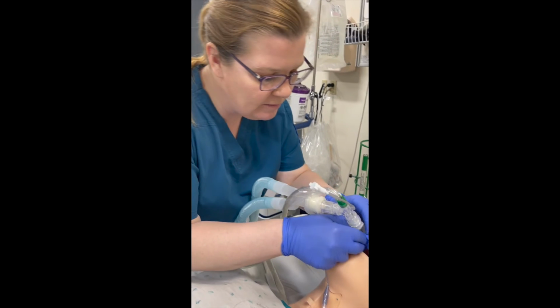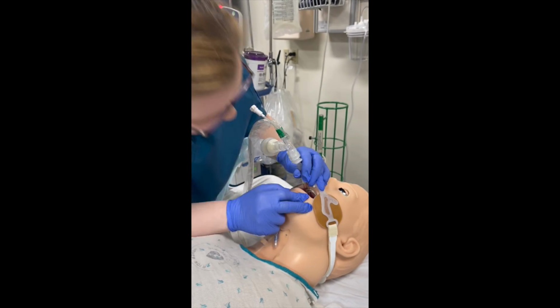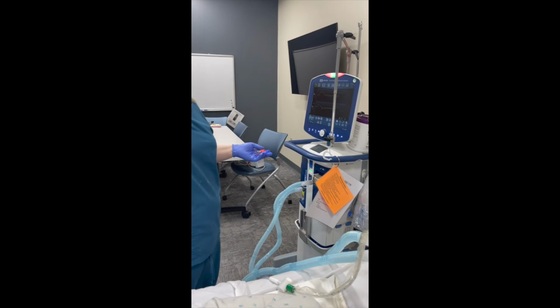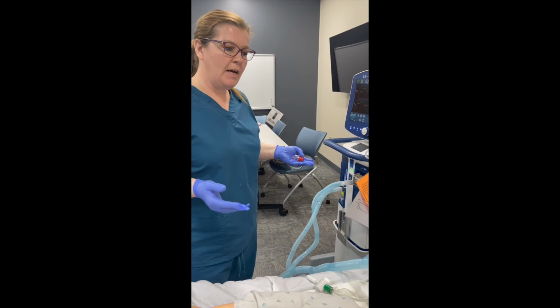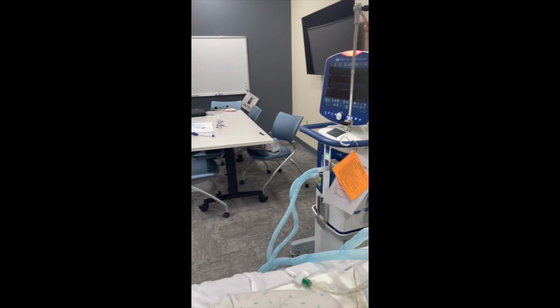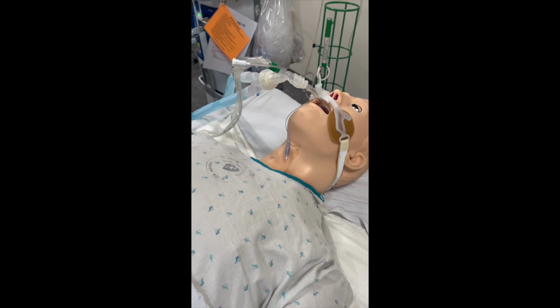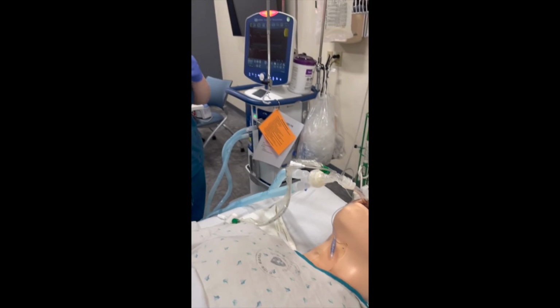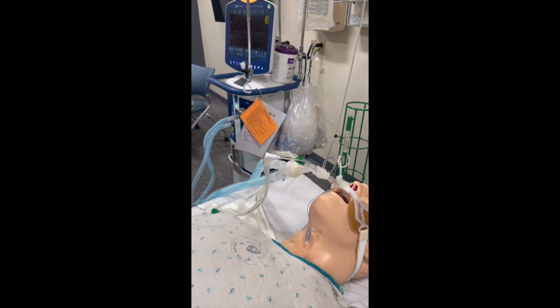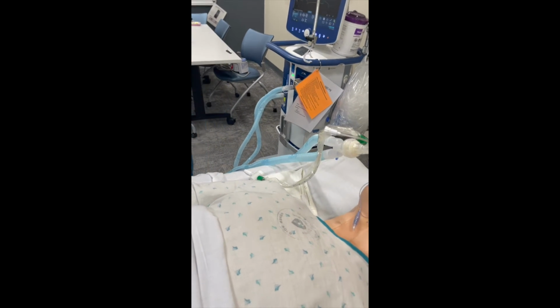Okay. So I'm gonna just confirm placement at the teeth again. We are at 25. And then I'm going to check my x-rays. So now I've checked my x-ray or my imaging to verify ETT placement. The endotracheal tube is sitting 5 to 7 above the carina.